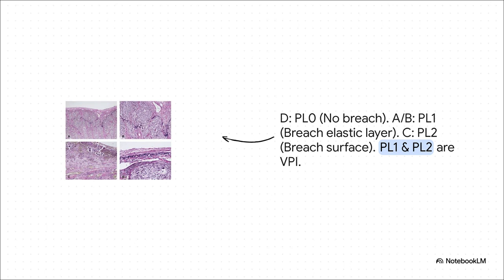This is why getting an elastic stain is so often essential. It helps you see that boundary crystal clear.